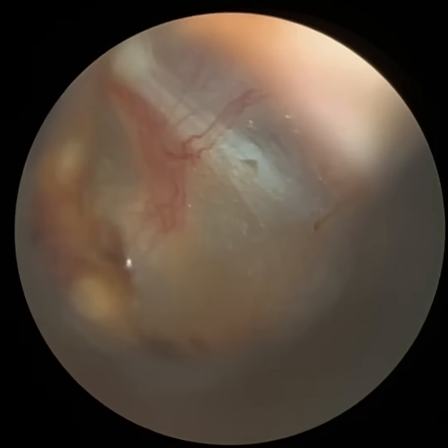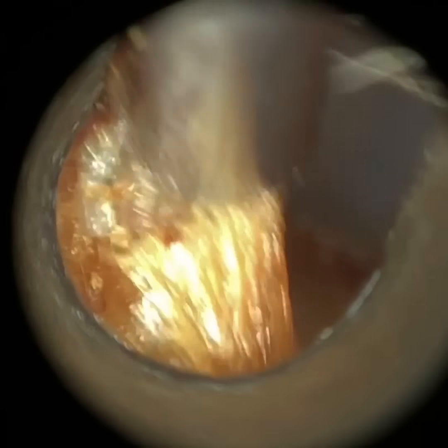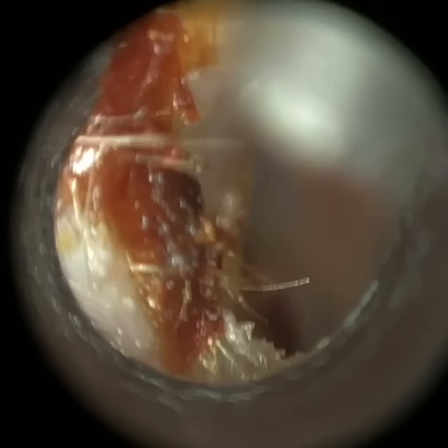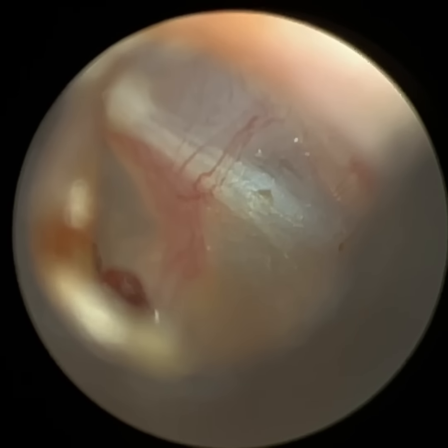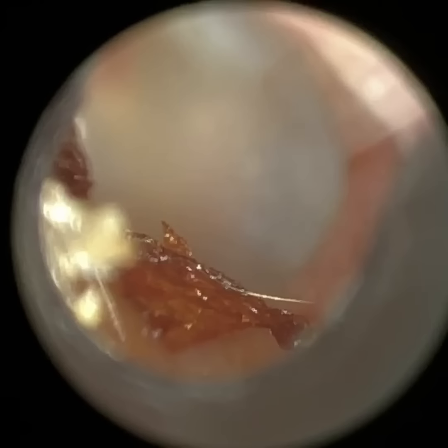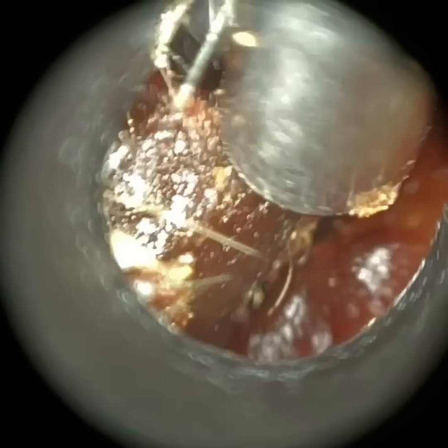Can you see the eardrum there? That gives you a good idea of how narrow this ear canal is. There's a bit of skin anteriorly and a bit deeper. As I was suctioning, we got a bit of clarinetting, so I stopped straight after it came away and left that bit of deeper skin — it's non-significant and I just didn't want it to clarinet. For those wondering what clarinetting is: when you suction dead skin, sometimes the skin can flap at the tip and emit a very loud, high-frequency squeal — loud for the patient and for myself. Sound levels can exceed 110 to 120 decibels, and you want to be careful of noise-induced hearing loss. The benefit-to-risk ratio of removing that skin wasn't really there, so we left it.